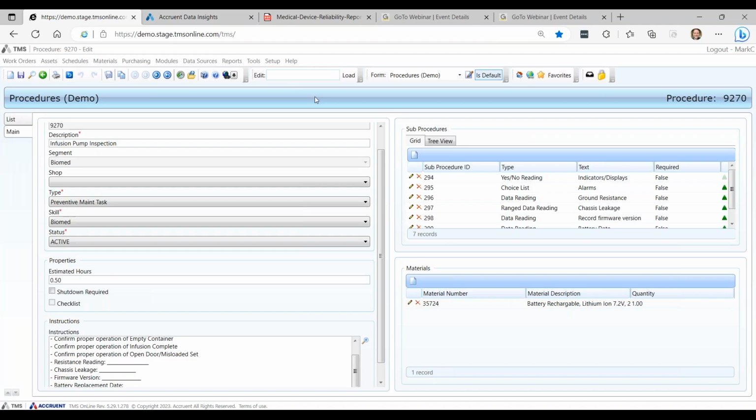So I had a question. You know how you mentioned that the checklist and the procedures are tied in, you just do a search? My question was, you have multiple devices with the same make and model. You pretty much use the same generic checklist, which is tied to it. And then comes the PM load balancing, right? How many work orders you have for that. So how does that work basically?